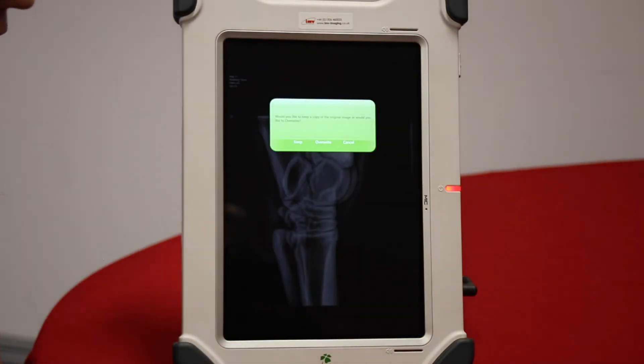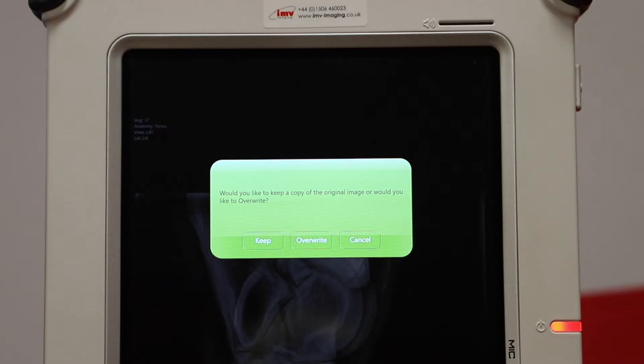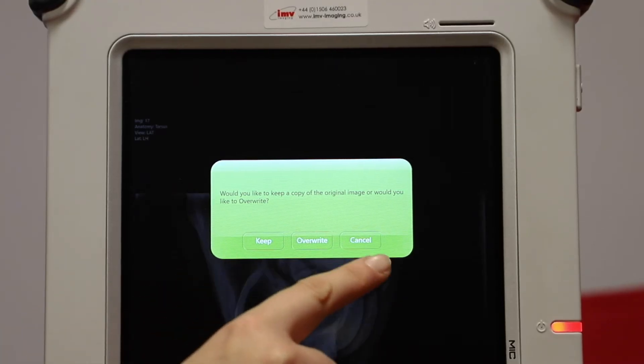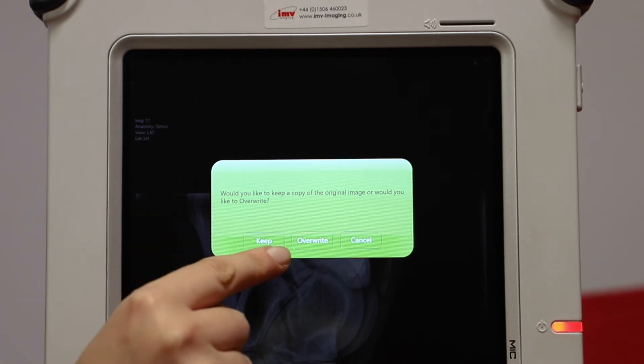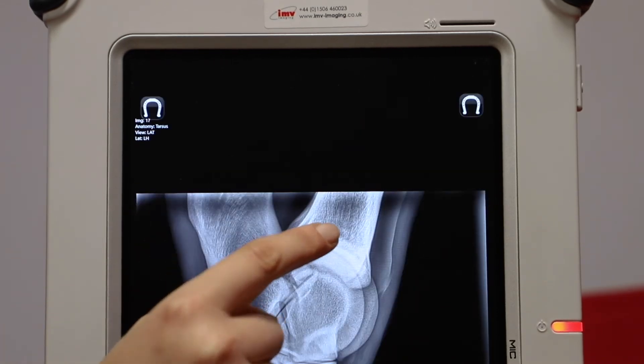Save any changes. Sometimes the machine will ask you if you want to keep the image as an addition, overwrite it, or cancel. I'm going to overwrite.